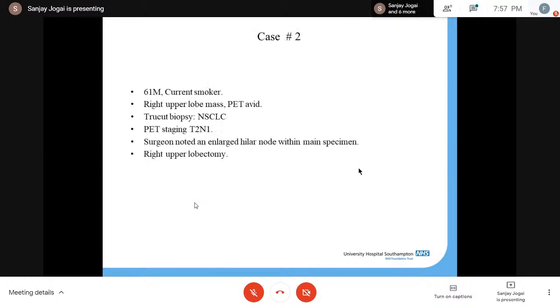Now, leaving the neuroendocrine discussion aside, we can move to another case. At this stage, did anyone want to say anything or share their experience? I think yes, Dr. Jogai, Dr. Rajiv, before I go on. Dr. Rajiv Bansal had a question on why Ki67 is not part of the standard diagnostic panel, why it's not recommended. Am I right, Dr. Rajiv?